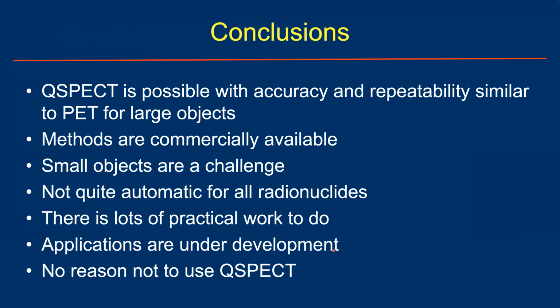Because the reconstruction depends on the radionuclide and the decay chain, it's not automatic processing as compared to PET. We only have 511 keV photons. Reconstruction is simpler, but for SPECT, you have to carefully validate the reconstruction method for each radionuclide. So there is still a lot of practical work to do to develop and validate optimal reconstruction for different radionuclides. And there are many applications under development.